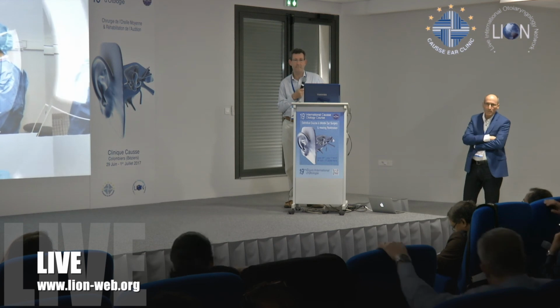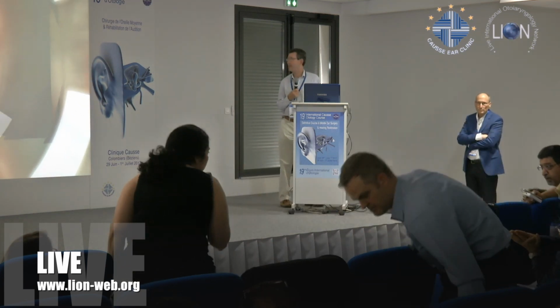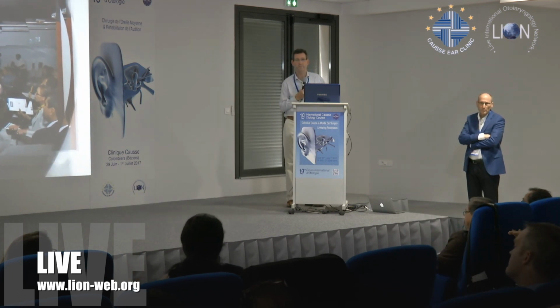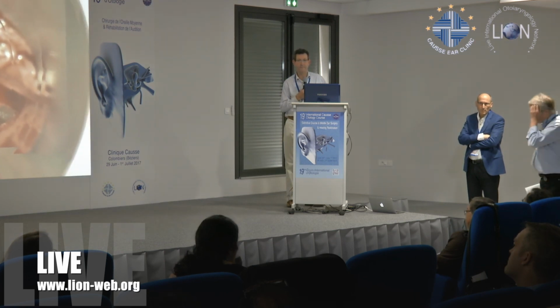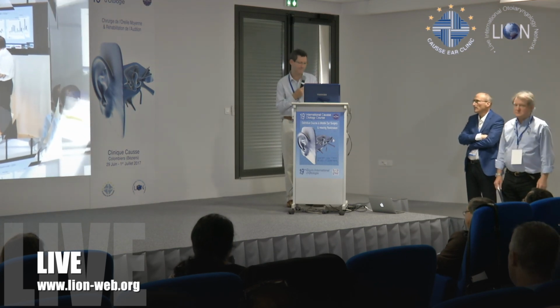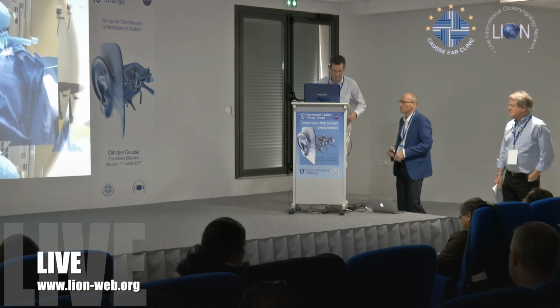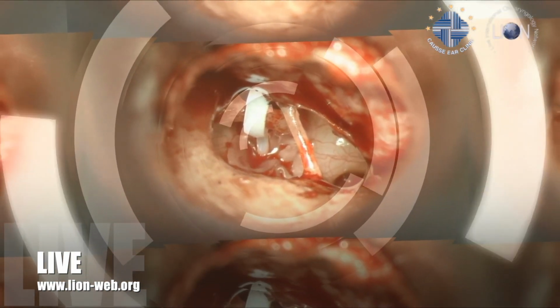Yeah, the problem with doing very young children is that you end up with a 3 millimeter implant, and the extrusion rate for 3 millimeter implants is significantly higher than 4 millimeter implants. You've got a 3 millimeter implant, but you've only got 2 millimeters of bone. That's the problem. It's a real mess. So the longer you can have that child use a soft band, which really works very well, and then when they're 5 or 6 and you can put in a 4 millimeter implant, that will last them a long time.